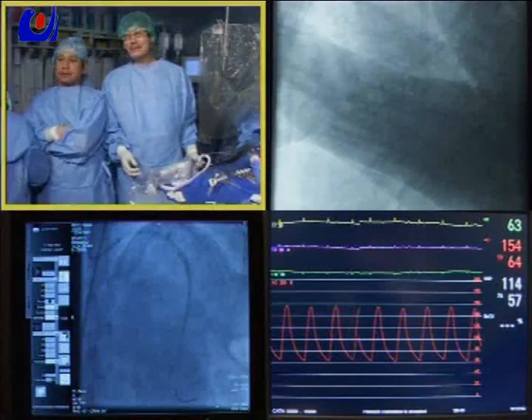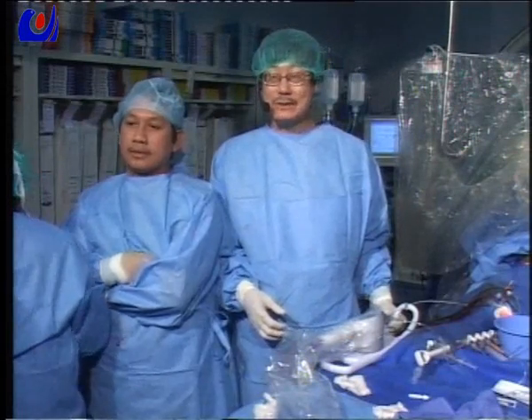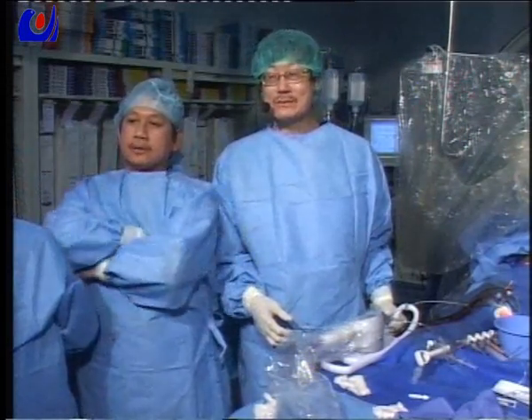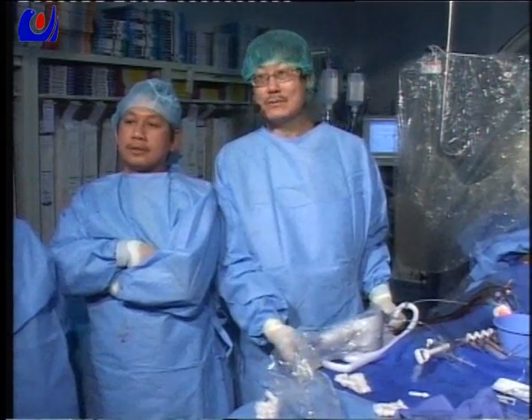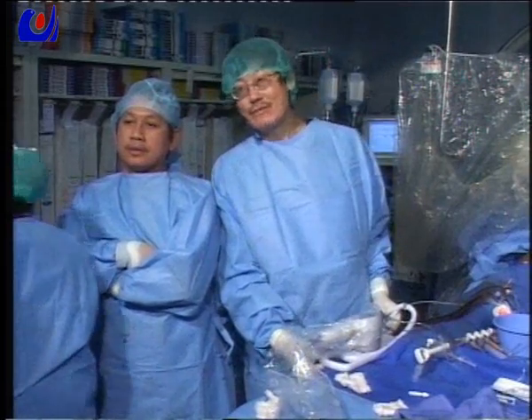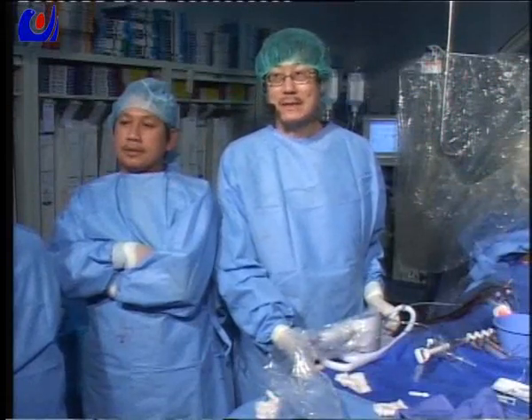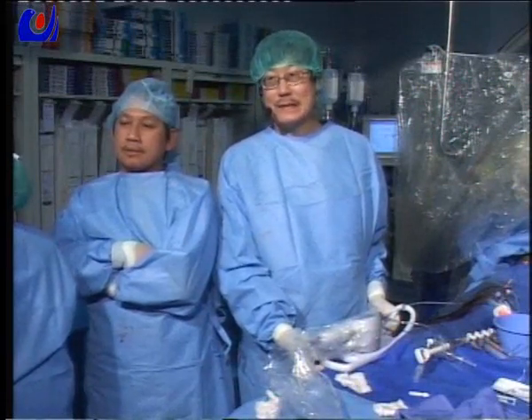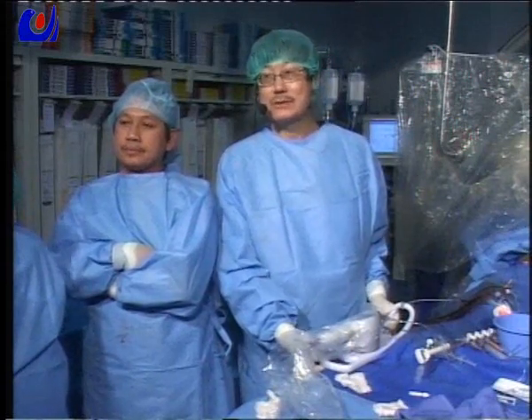The proximal portion I'm quite happy because you can see that we use 3.0 high pressure, push up to 20, then 24, 26. Finally, we didn't use a 3.5 high pressure. We are using a 3.0 and the 2.5 for left main bifurcation kissing balloon inflation. We got up to 16 for both.